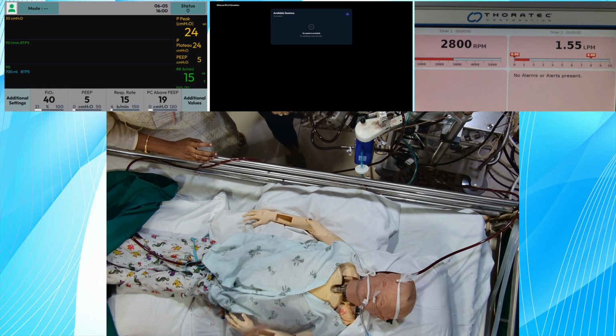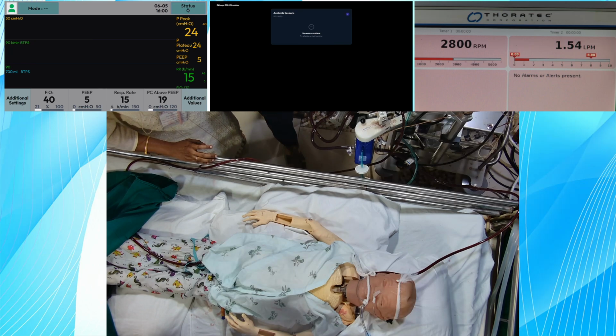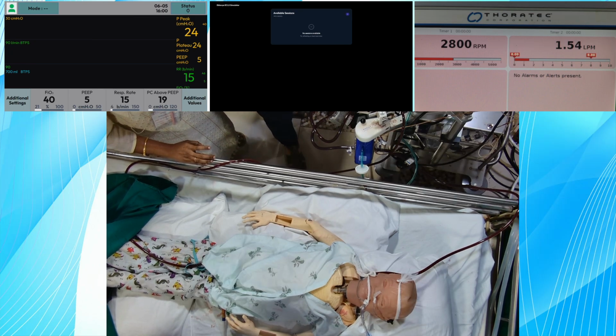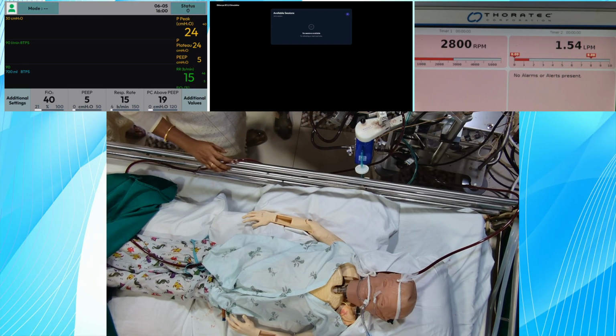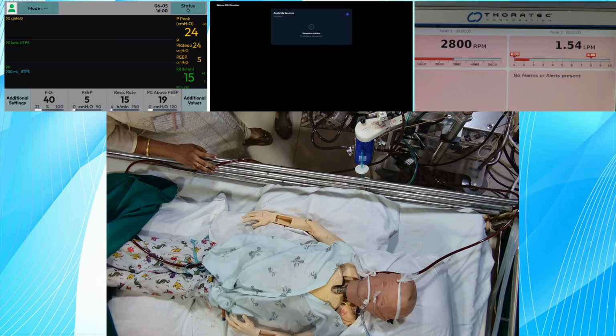To the flow meter, excluding the blender, onto the direct flow meter. You want to connect to the oxygen cylinder? Yes, give them the oxygen cylinder. Is there any problem with the blender? So do it. Then we do a torch test to look at the oxygenator for any clots.